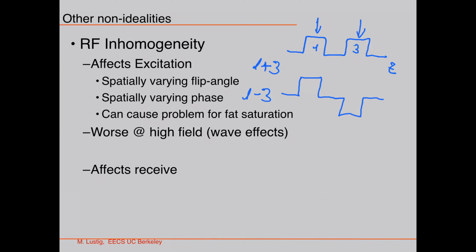But then you could do more than that. Like you can do 4, up to 8. Beyond 8, the amount of power, because the time bandwidth has to increase, so the amount of power you're going to be depositing is significant. So it's not efficient above 8.